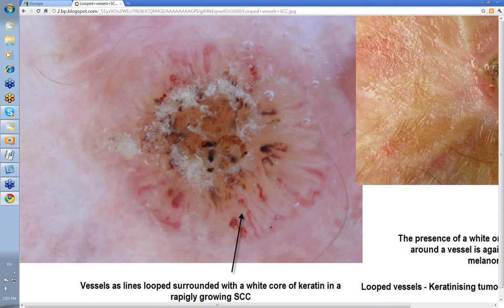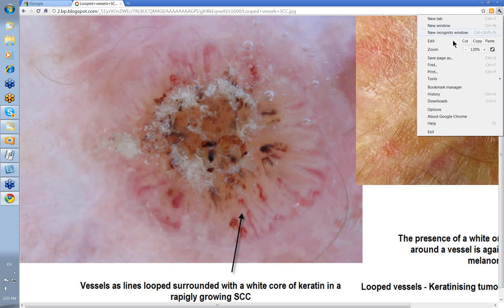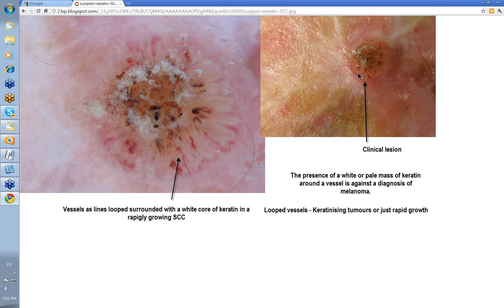Most SCCs are going to show vessels as lines looped just at the edge with that white keratin core surrounding them. This is what you'd see in a rapidly growing SCC. Here was the clinical — you can almost see the vessels just at the edges here in this rapidly growing region. In a well-differentiated SCC or keratoacanthoma, same thing: you'll still see these looped vessels at the edges surrounded by keratin.